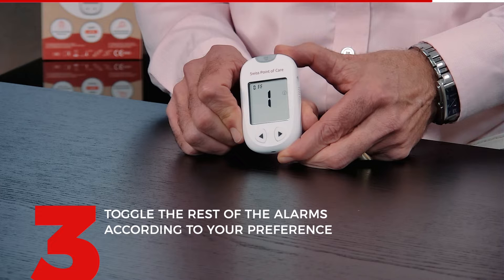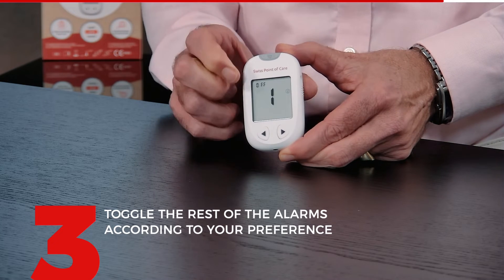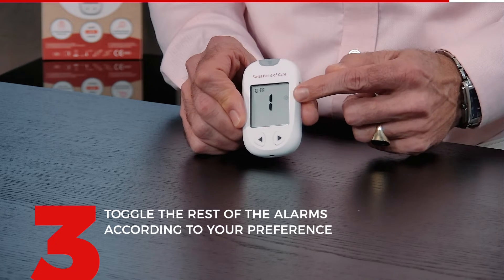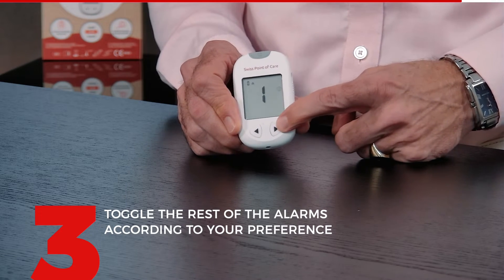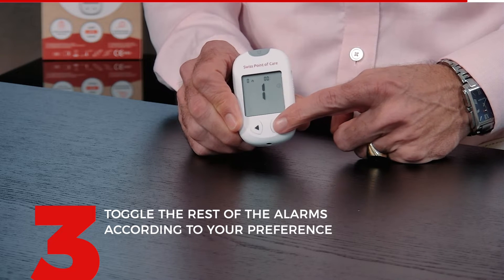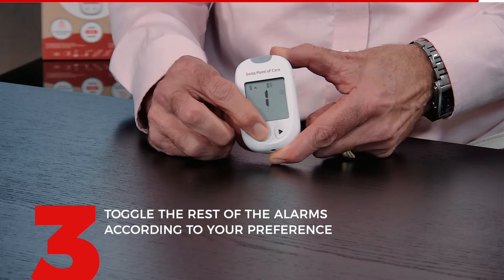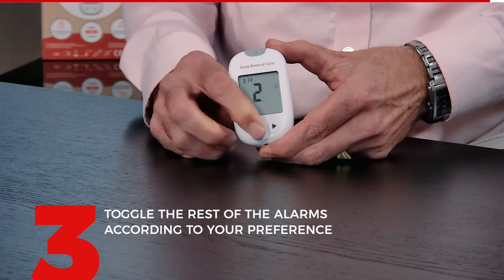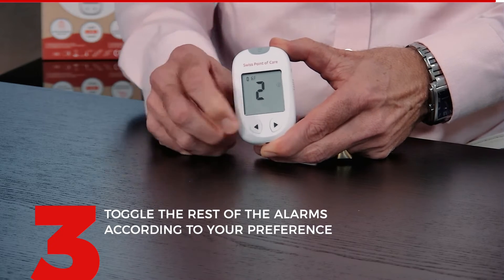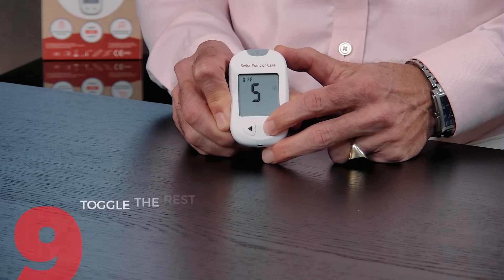Now you have the ability to set an alarm. This is especially important if you need to be reminded of when you should do a measurement. You can choose alarm number one — put it off or on. If you put it on, press the right to confirm, and you can say what time you want the alarm. I'll put the first one at 8 o'clock in the morning. With the right I confirm. The second alarm you can turn on by clicking on the left, or leave it off. There are alarms number three, four, and five — you have a total of five alarms that you can set.